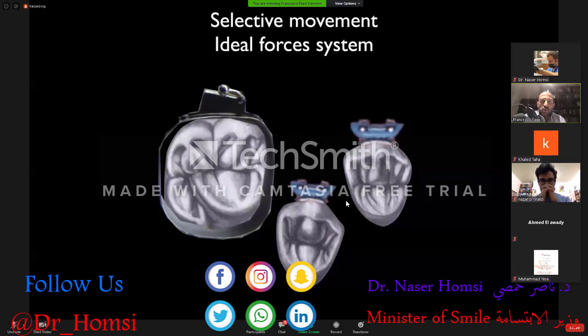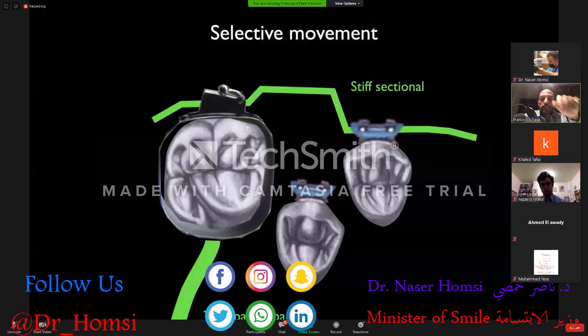If we decided to have a selective movement of the premolar in a buccal way, we could consider the segmentary technique. The technique allows us not to move the teeth that are in an initial good position, such as the first molar and the first upper premolar.